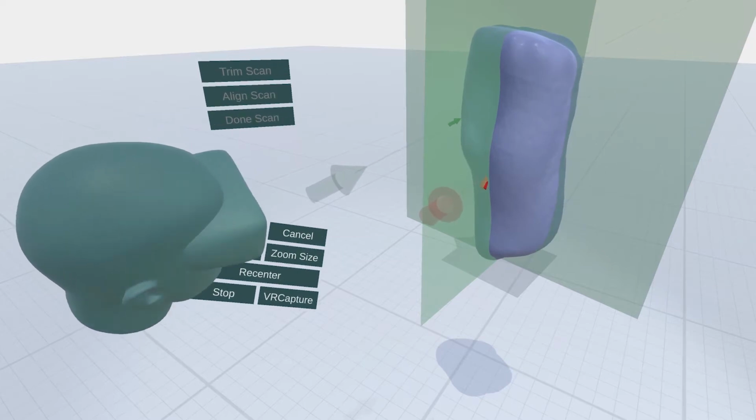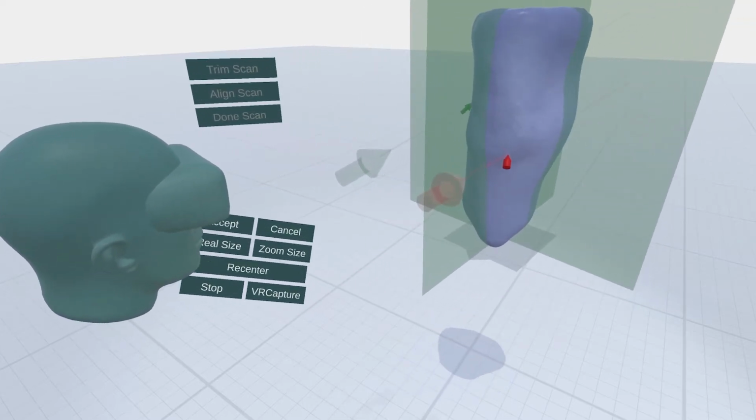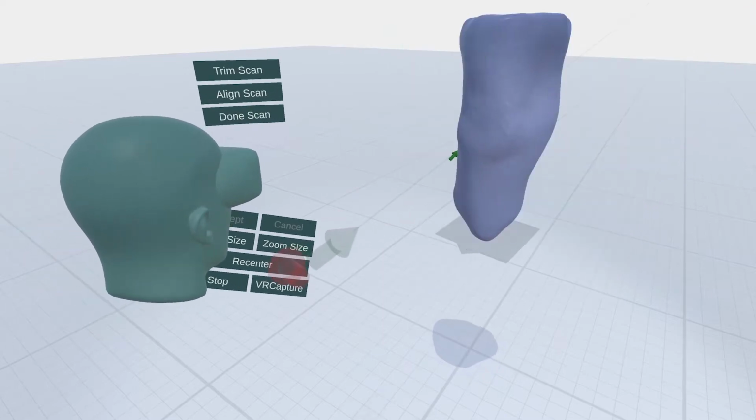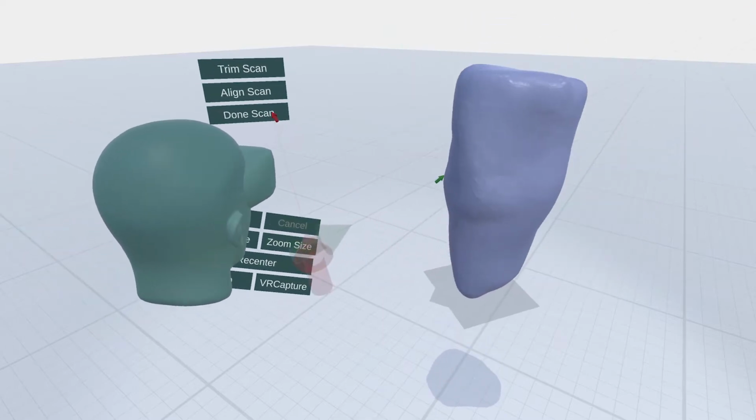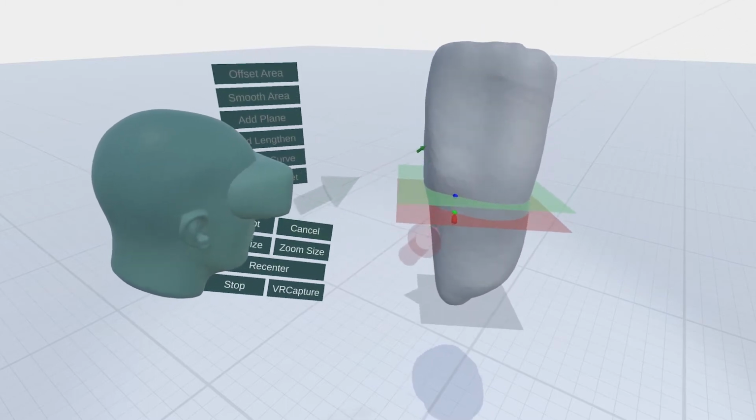This is a critical step. If the socket base is misaligned, then it will not properly support the wearer and be uncomfortable. VR makes this much easier because the prosthetist can simply grab the limb and rotate it, just like they would with a physical plaster cast.